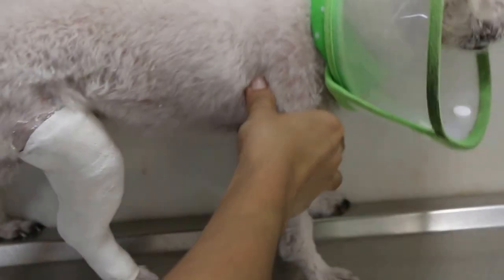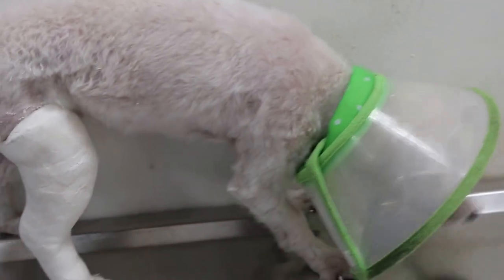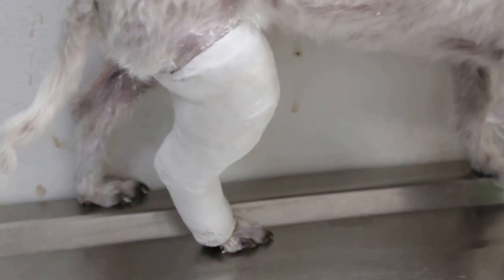Let's bring it down and see — is it swollen? The paw is not swollen. Put it a bit further to the side. Let me see, I'll come down here. Put it straight against the wall first. And you can see that — hand off, otherwise I can't video here. If the paw is not swollen, does it look swollen? Compared to the other paw, no it doesn't look swollen.